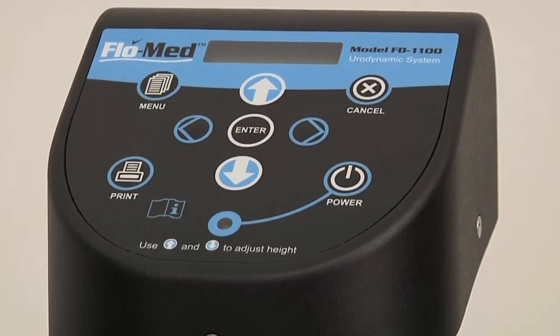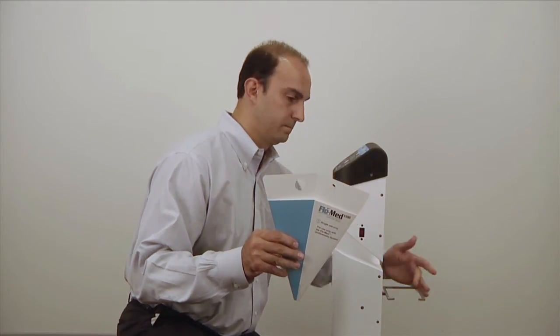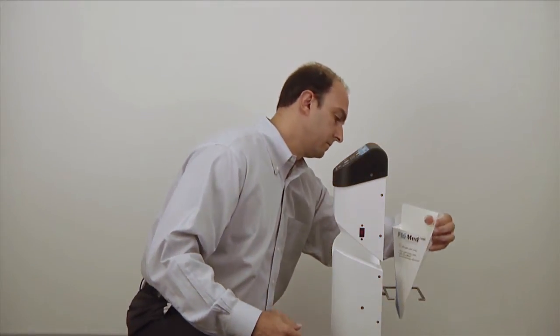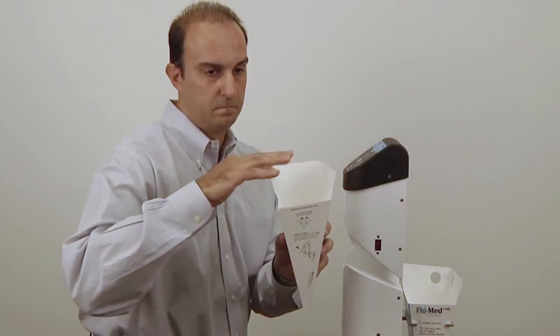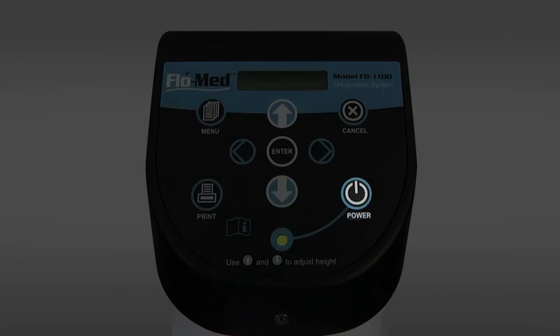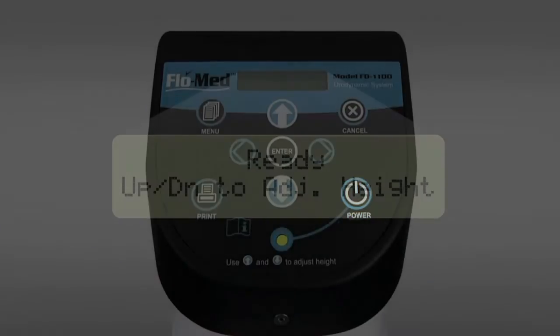Operation of the FlowMed 1100 is easy. Gently pull down the perch and insert the collection cup — the collection cup is the one with the gripping holes. Insert the funnel into the device with the flaps on the bottom. Press the power button and wait for the LCD screen to display ready.